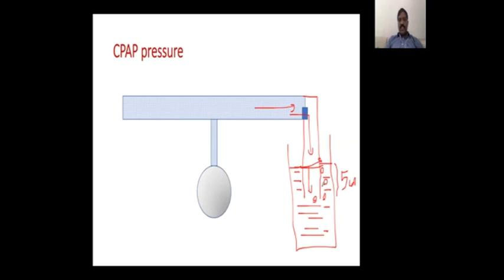So now this is 5 centimeter resistance, created because this column has to move 5 centimeter from the bottom till the water level. Since you created this 5 centimeter resistance, the gas in the circuit will leak to the atmosphere only when the pressure in the tube is more than 5 centimeters. So maybe when it is more than 5.1, the gas will leak out to the atmosphere.